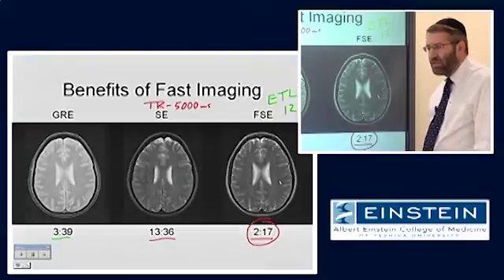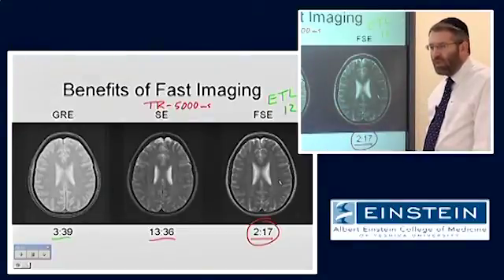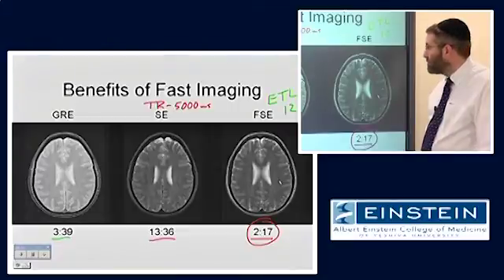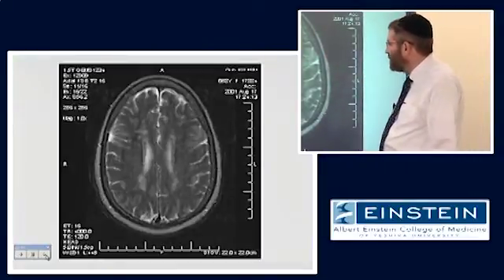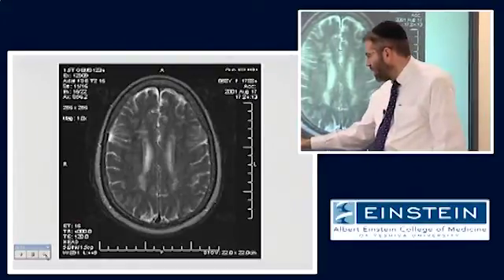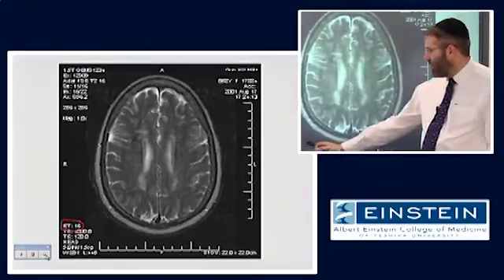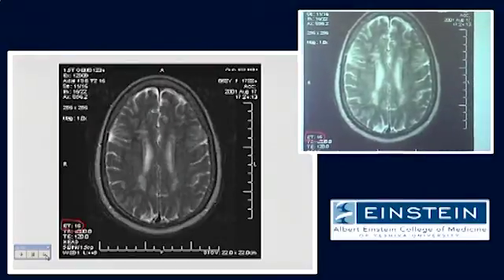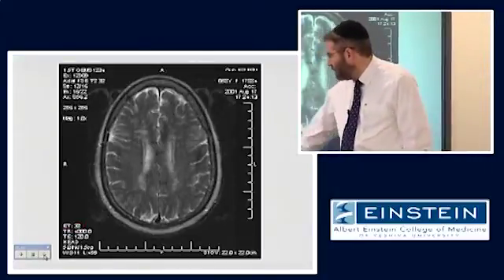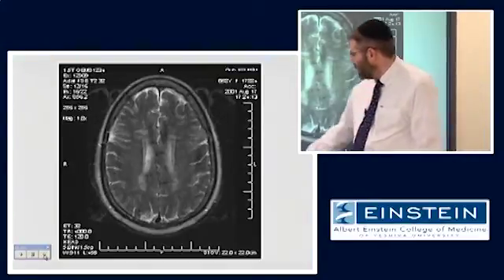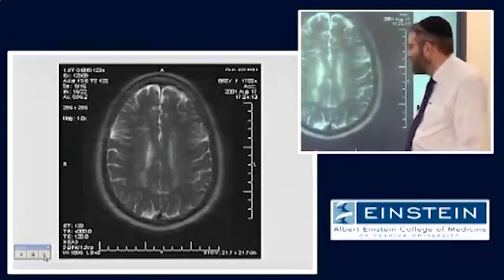FLAIR images use TRs over 10 seconds — FLAIR was virtually not possible when all we had was spin-echo imaging. This is a series of T2-weighted fast spin-echo images acquired with different echo trains: 16, 32, 64, and 128 echoes following each TR.